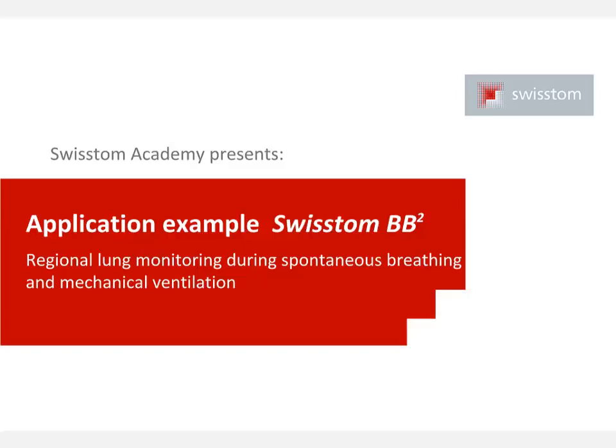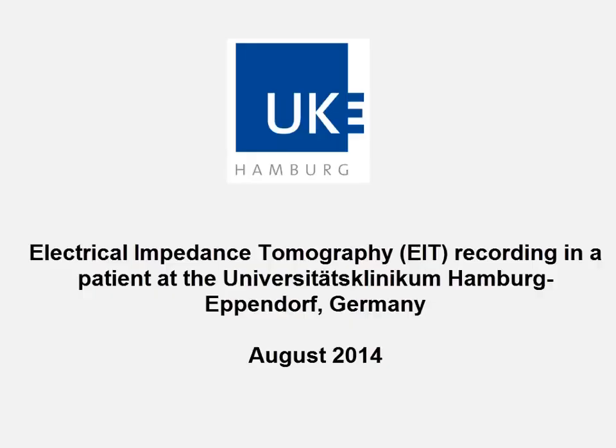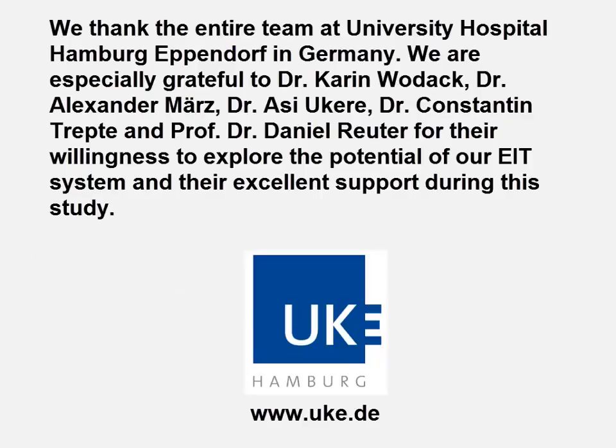In this video, we are presenting a patient undergoing robot-assisted radical prostatectomy while his lung function was monitored by electrical impedance tomography, EIT. The recordings were performed at the University Hospital, Hamburg-Eppendorf, Germany. We thank the entire team of Professor Reuter for their willingness to explore with us the potential of electrical impedance tomography in this field of application.